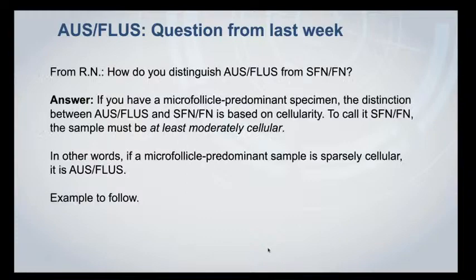So we had a question from somebody who attended last week's session. Thank you, RN, for your question. You asked, how do you distinguish AUS/FLUS from suspicious for follicular neoplasm or follicular neoplasm?